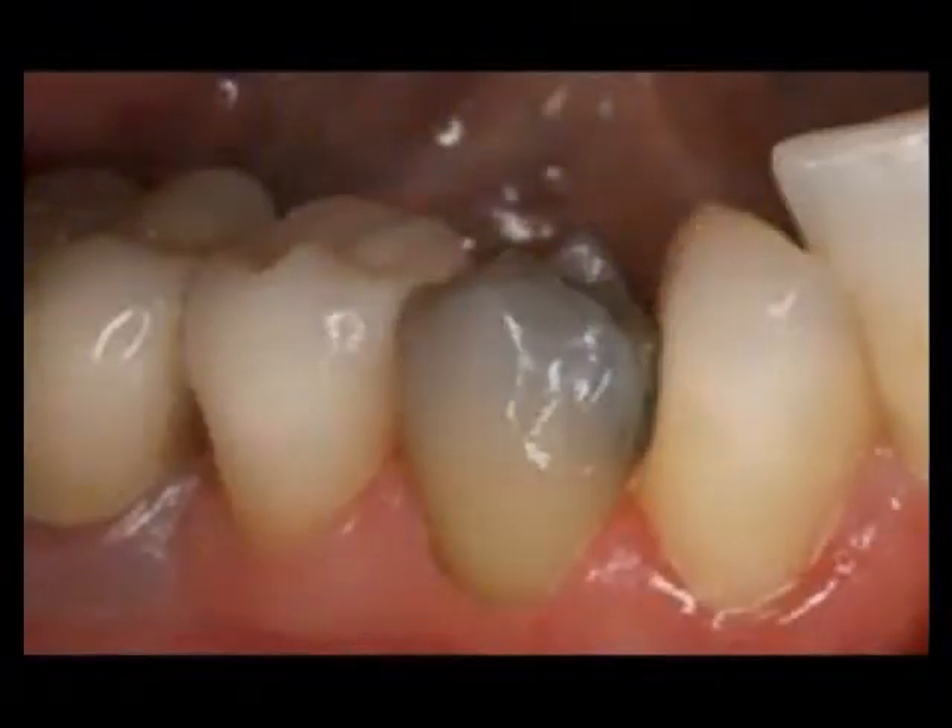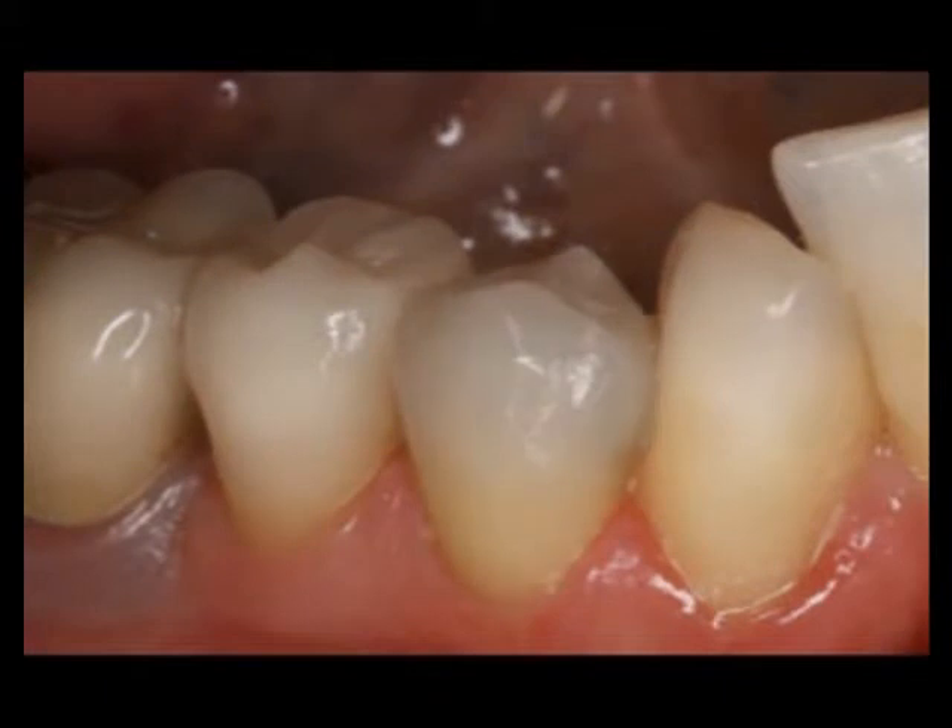While you wait approximately 15 minutes, your all-ceramic color-matched restoration is created. Your new restoration is fitted, polished, and bonded for performance. Your new tooth is restored back to its natural form, function, and beauty.